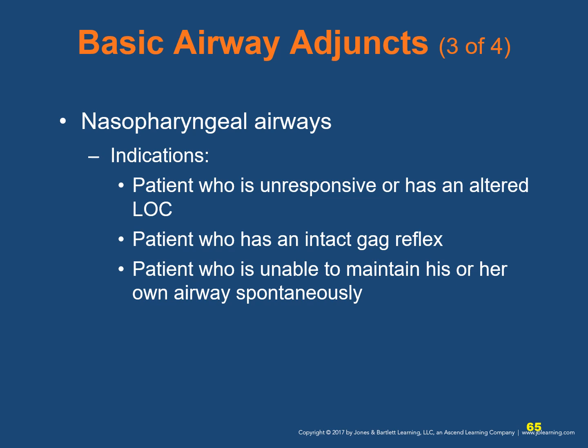Now we're going to discuss nasopharyngeal airways. The indications are a patient who's unresponsive or has an altered level of consciousness, a patient who has an intact gag reflex, or a patient who is unable to maintain his or her own airway spontaneously.